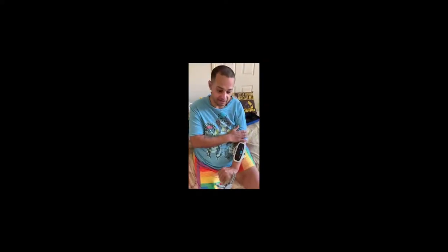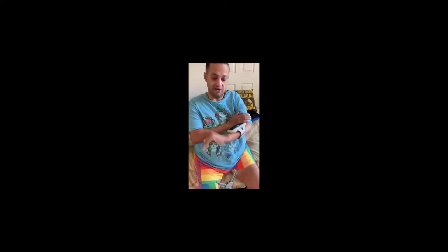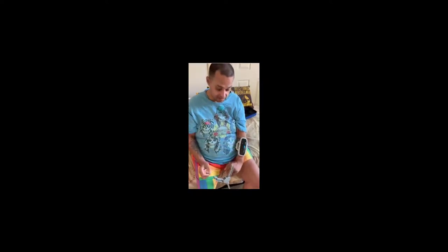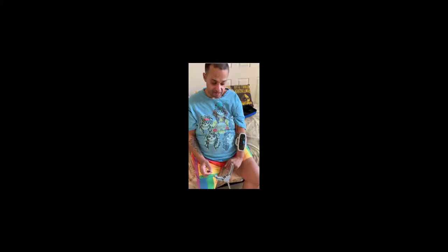So again, on the count of 3, 1, 2, 3. My hand opened up a little early there because I thought about it and it sent that signal down quicker than I thought. So again, I'm just thinking about opening my hand up and it's opening. I'm not actually forcing it. So right now I'm just thinking in my head.